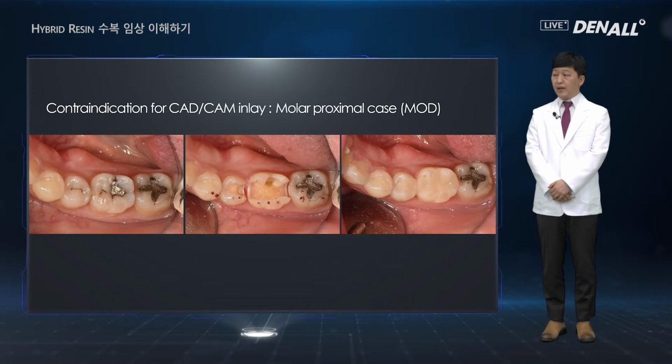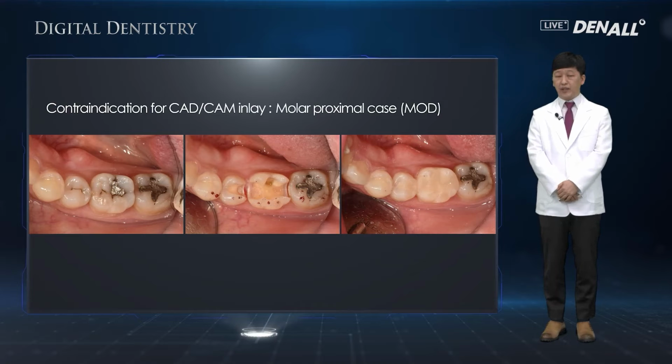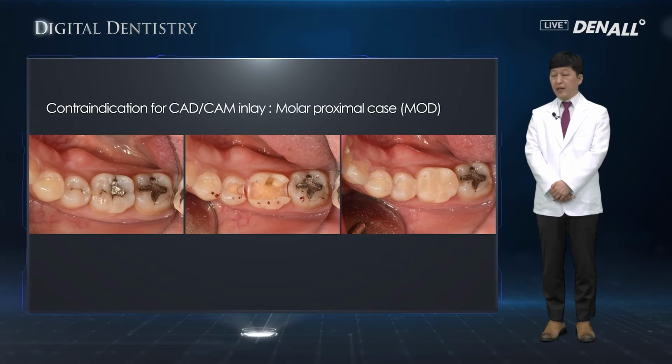In the molar area, posterior area, if excessive proximal case is included, it is not recommended. In this case, crown should be used to get better result.